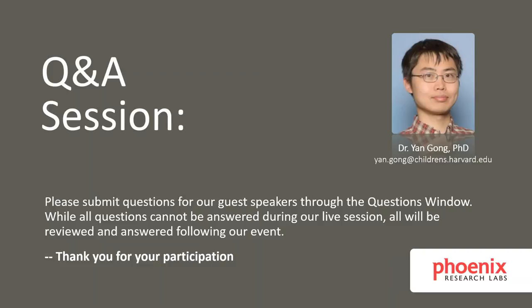Yeah. Thanks, Dr. Gong. As Dr. Gong pointed out, the use of the OCT is pretty common for CNV studies. What it allows you to do is to take a 3D image. You can take an individual slice from that 3D image at about the same level as the CNV. We can take that slice and then use our InSight analysis software to evaluate the area of that particular slice. So it's a great way to check whether you're seeing advancement of your particular CNV. Great, thank you both. That was very detailed and well-informed.